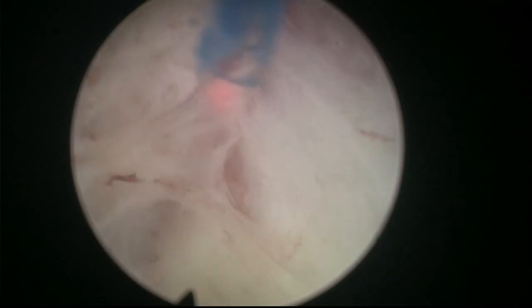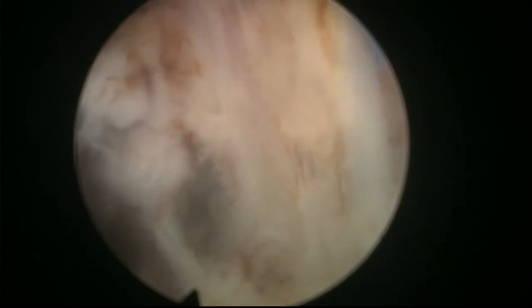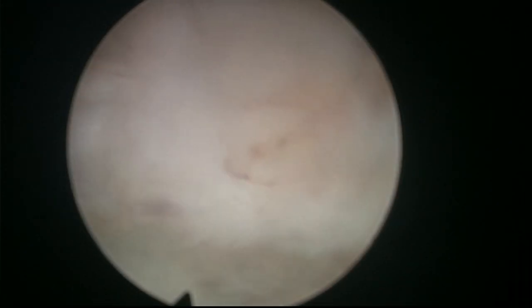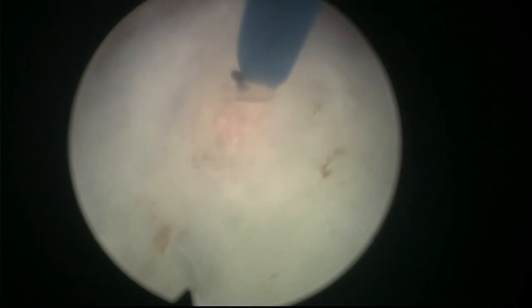Almost there, almost there. Now I have done the apical release. This is coming towards 12 o'clock. I want to reach the 12 o'clock area and follow the circumference, the contour of the capsule, to remove all the tissue around. There's a bleeder there but let's see. Again, we are going to replicate exactly what we did from the other side.